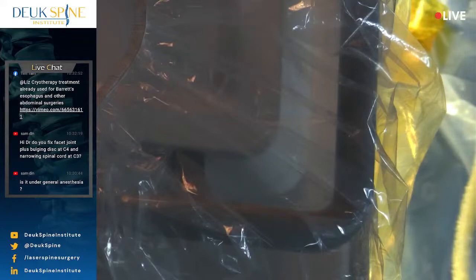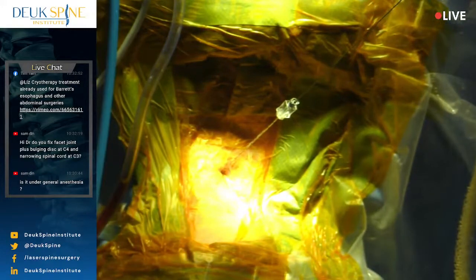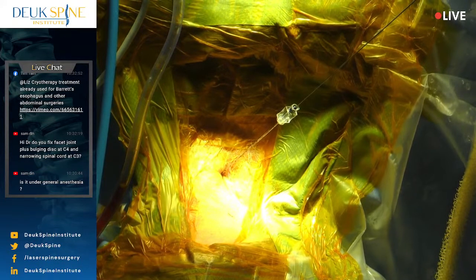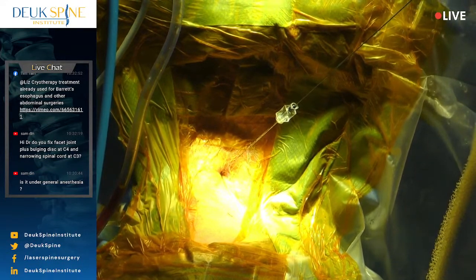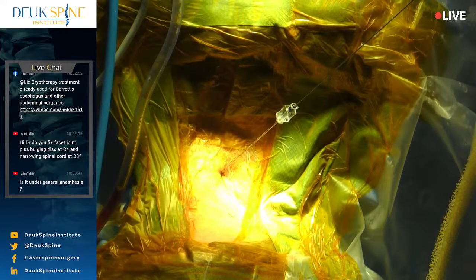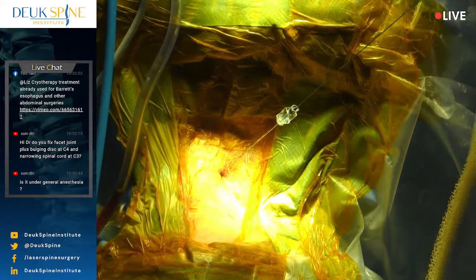Okay, look at that tear. Okay, that's dye around the nerve root, I believe. That's pretty cool. Show them the dye around the nerve root. That is actually the C7 nerve root. Show them. Monica is going to go over. Just have the fluoro picture up, guys. Okay. Hello, Chet. Earth to Chet. No, that's extravasated in the soft tissue. Show the root coming out of the foramen.